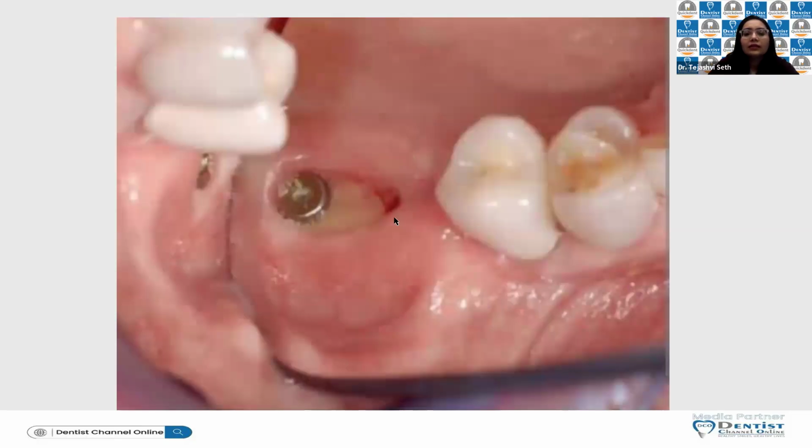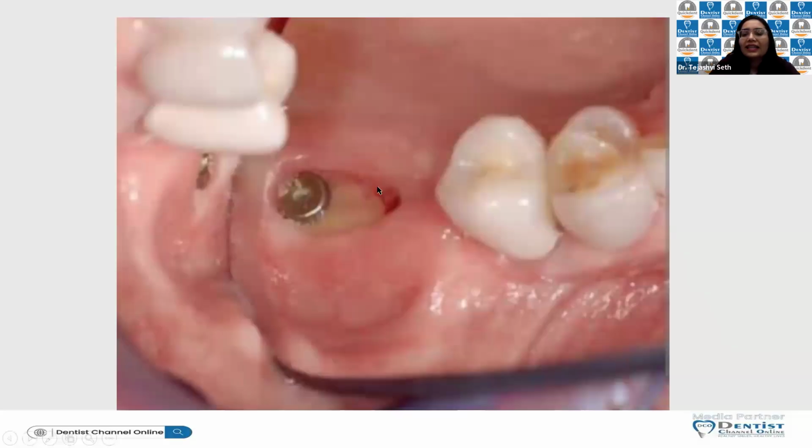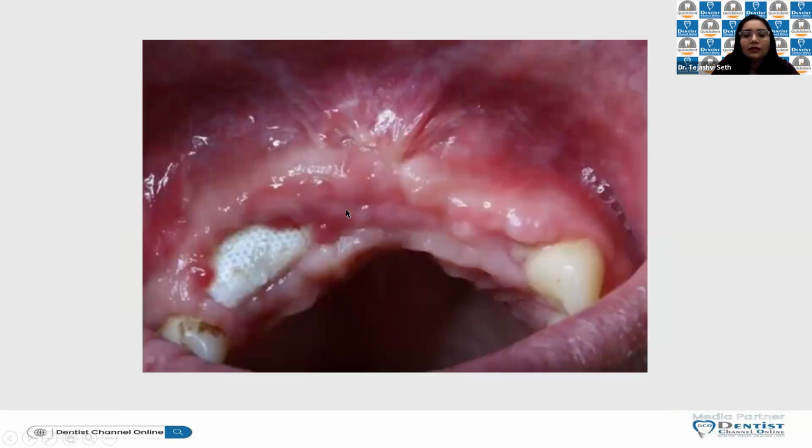Again, this slide, if you see, there's dehiscence. This is a single implant placement, but if there is a dehiscence, it will affect the longevity of your implant. And now if you come to this, which is a very aesthetic zone, your anterior aesthetic zone, there are a lot of things going wrong in this slide. Your incision lines, or the tension pull from the frenum, the exposure of your membrane.